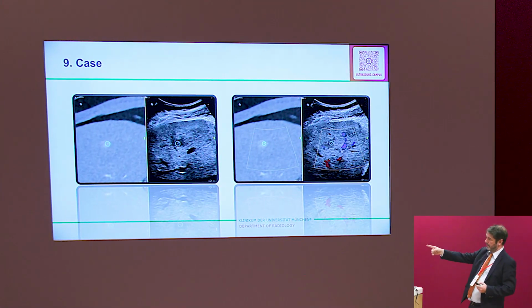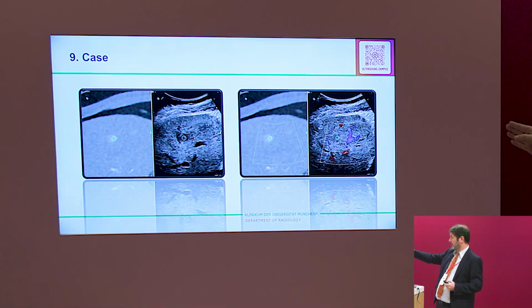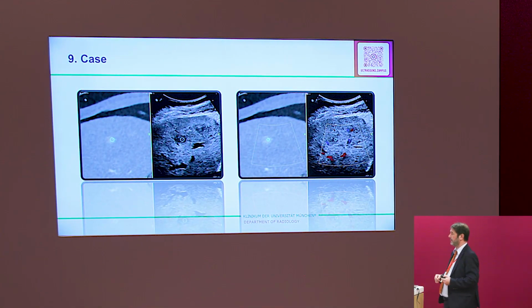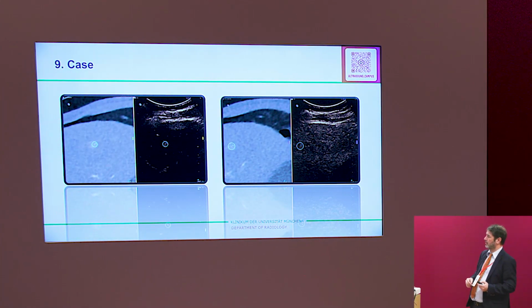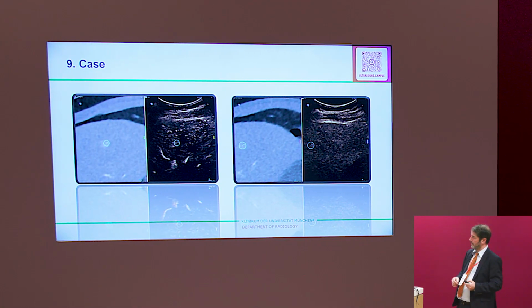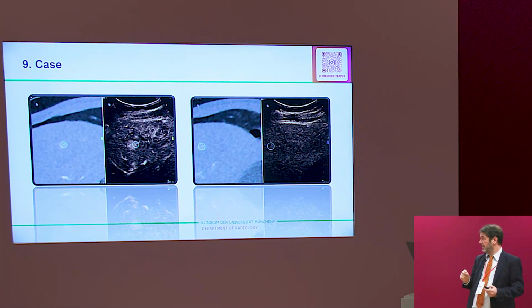You see the CT information, you see the blue circle. The circle is also transferred to grayscale and color Doppler. This lesion has a diameter of around 1 centimeter. Now we go to the contrast. Contrast arrived. You see very nicely this white spot where the blue circle is.